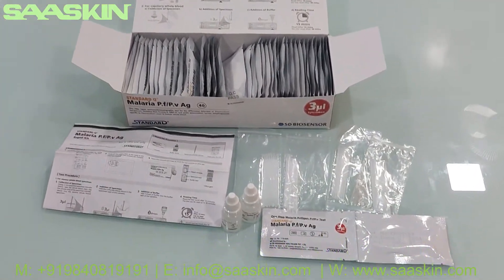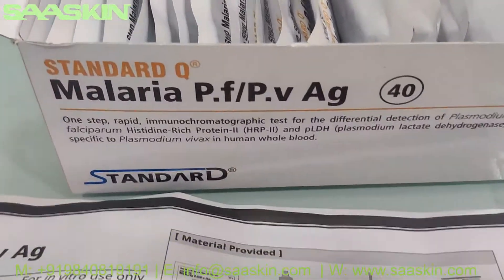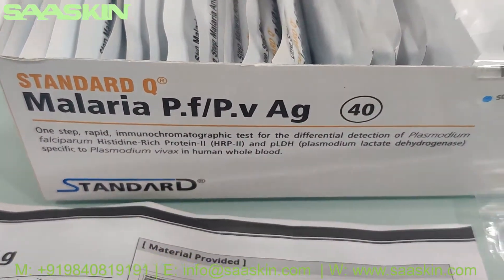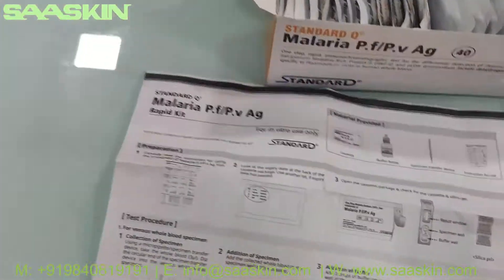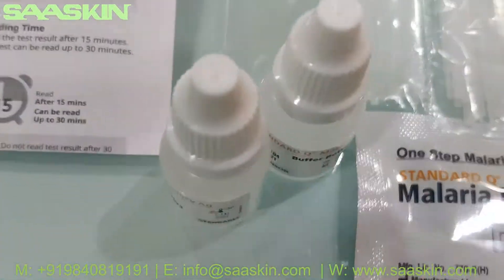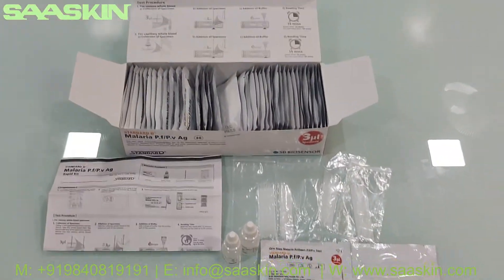To quickly summarize: this is the SD Biosensor Standard Q Malaria PF-PV antigen test kit. It contains an instruction manual, 40 specimen transfer devices, 40 test cassettes, and two bottles of buffer. This is how the complete test kit looks like.